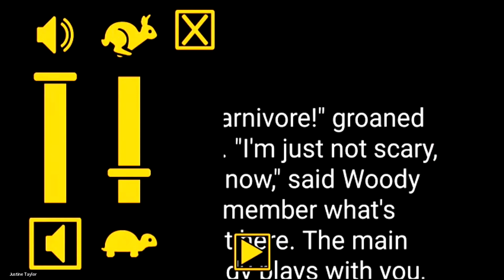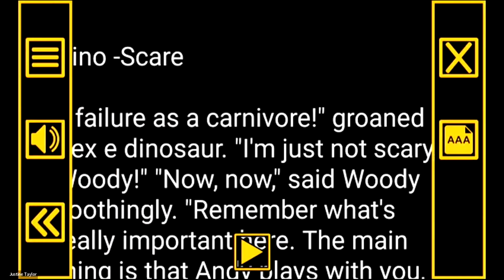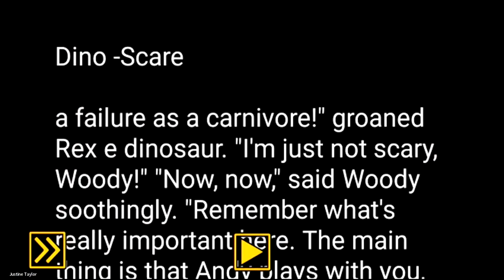Juno's new speech rate is set. So you can adjust that slider switch up and down to go faster or slower speech. Juno's new speed rate. So if we hit play, you can hear it really play fast.